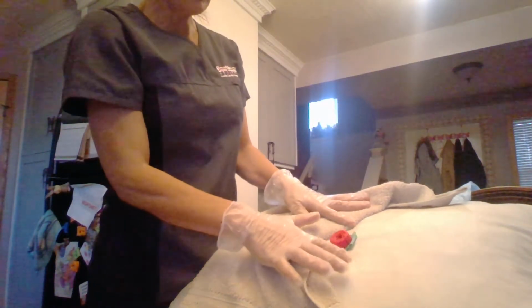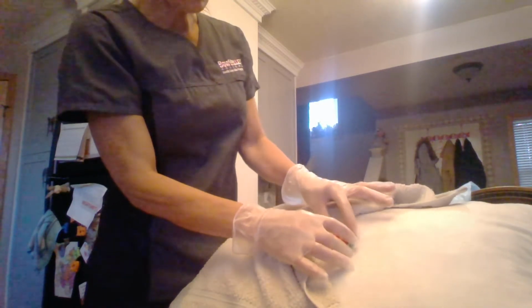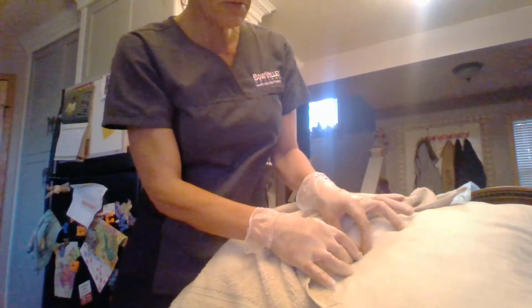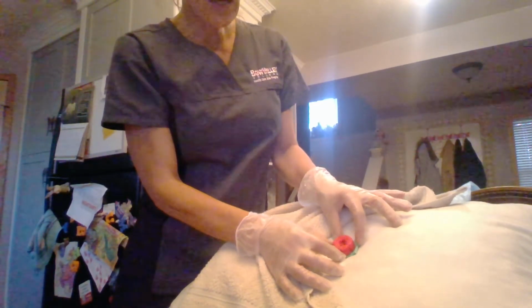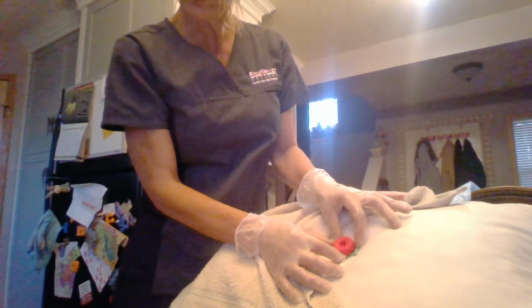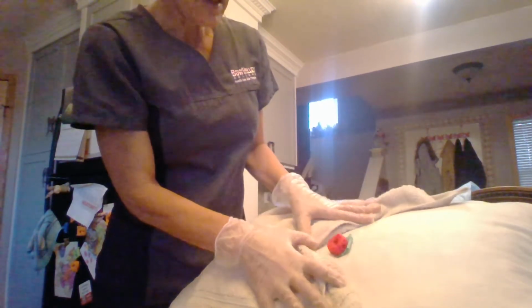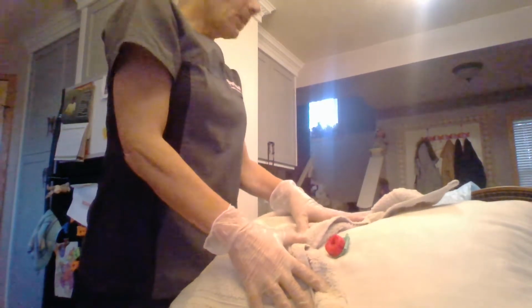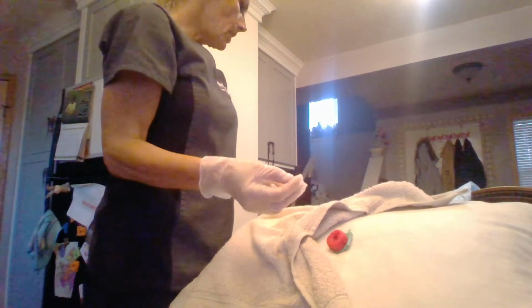Check the tissue around it for any cracks or discoloration or any other skin abrasions. Look at the stoma itself to make sure that it's pink and healthy and moist. So we try and dry this area out, possibly even air dry it.